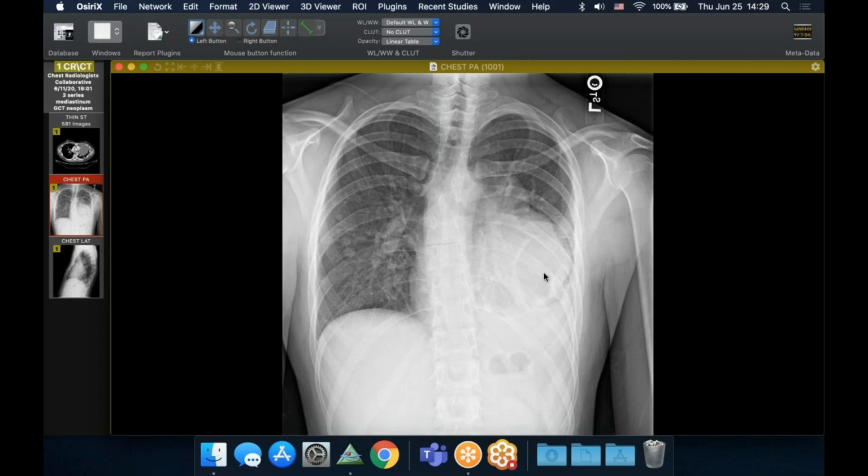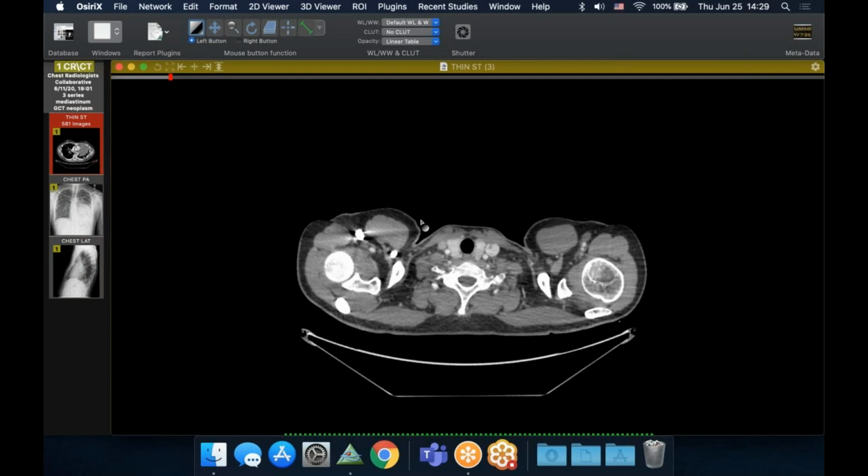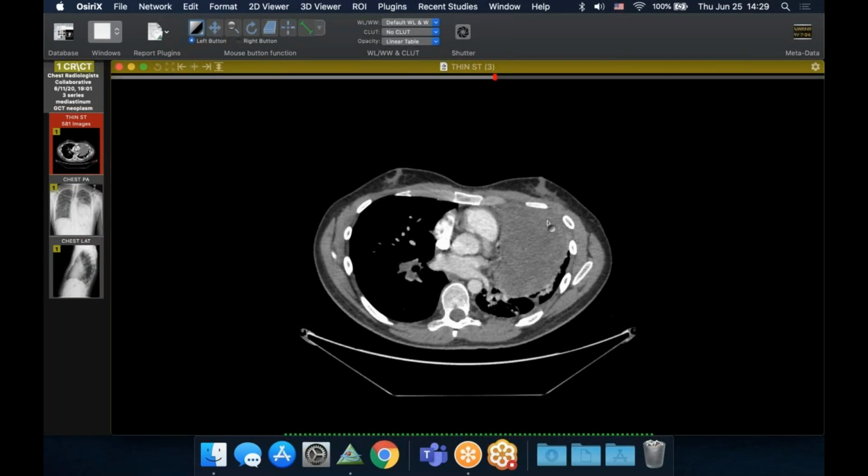You see he's got a big mass in his mediastinum, and he's got a bunch of lung nodules. Looks like some ugly kind of cancer, but he's a young guy. He's got sort of a funny looking torso, sort of a narrow chest. On his CT scan, he has fairly extensive gynecomastia for a young guy. I mean, who knows? We might see that. And this large mass here.